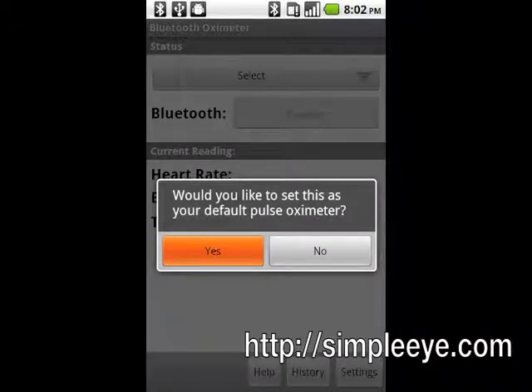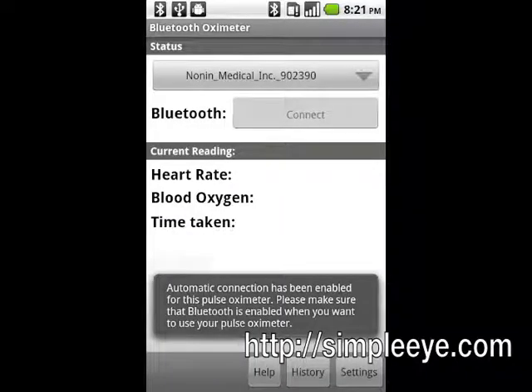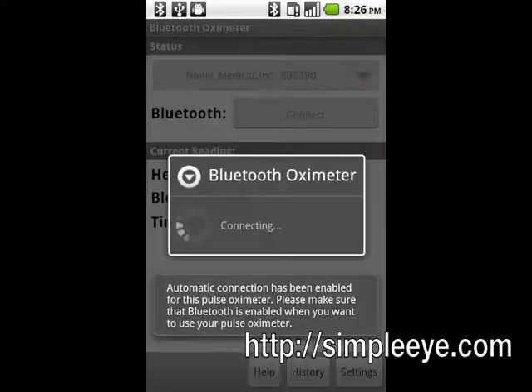You will then be prompted to have the program automatically connect to the pulse oximeter whenever it is turned on. Tap Yes. When this option is enabled, the application will automatically detect whenever the pulse oximeter is turned on and connect to it. You will be notified that your Android device's Bluetooth will need to be enabled for automatic connections to work. If you tapped Yes, the application will immediately connect to your pulse oximeter.